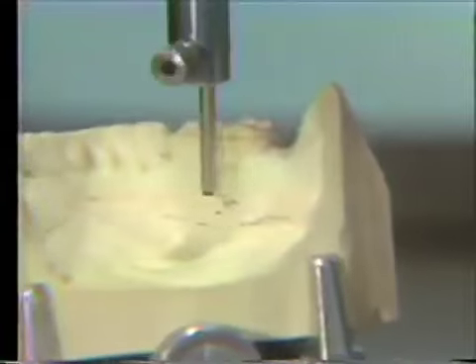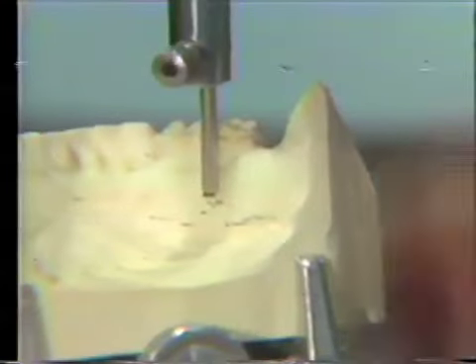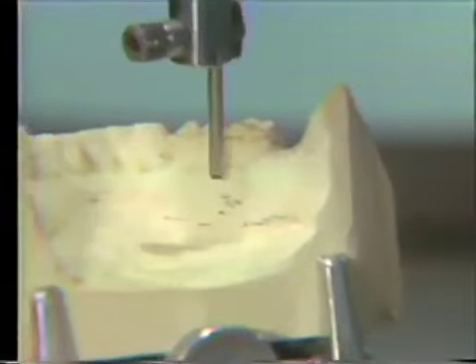Now I'm just going to see if I start out with this area on the lingual aspect of that anterior tooth and see if I can match it up with anything, and I have difficulty matching it to anything on this residual ridge, or anything that seems to be too low to really get anything of importance.